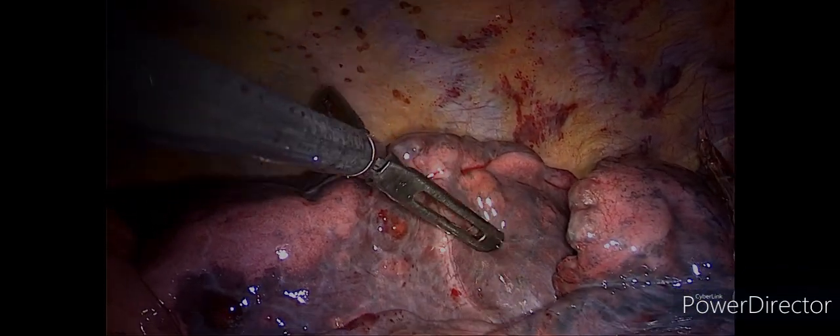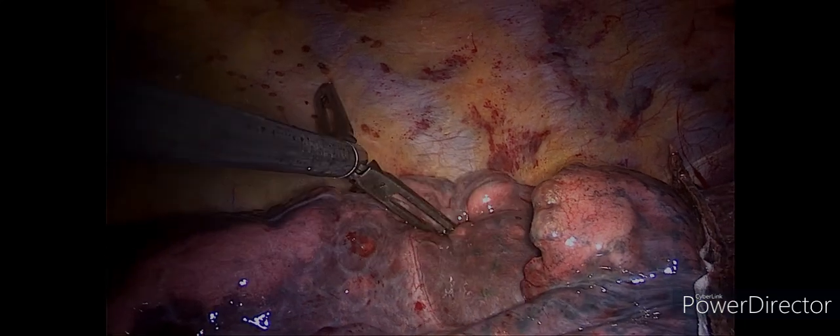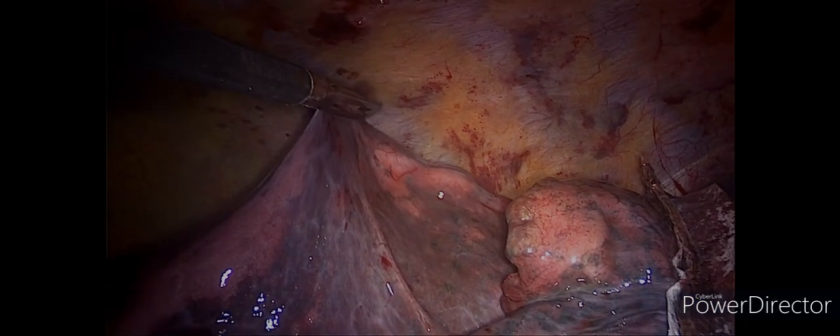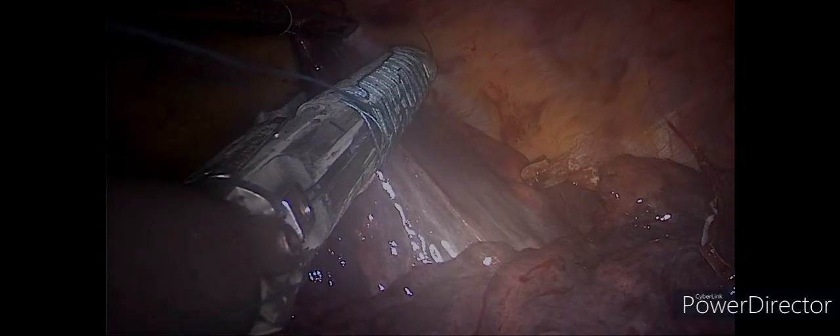These were along the basal segment of the lower lobe, and like I mentioned, we wanted to remove as many bullae as possible, with minimum resection of normal healthy tissue.